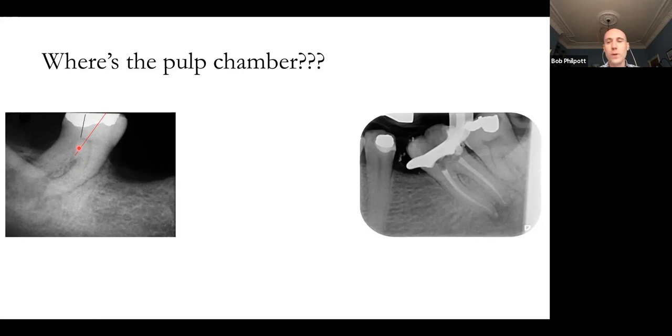Because, okay, if you gouge the pulp chamber floor, you might weaken the tooth slightly and you might complicate the location of your canals. But if you perforate a tooth cervically, as we looked at last time, it depends upon its size and its location. It might be that you go off angle and you come out here. And depending on how long you leave it there unattended, unfilled, undressed, the worse an effect that will have on the outcome.